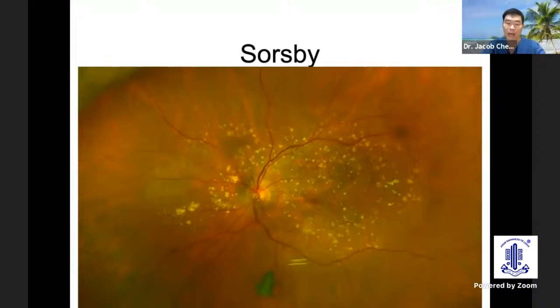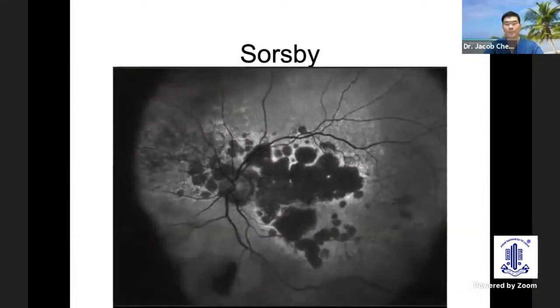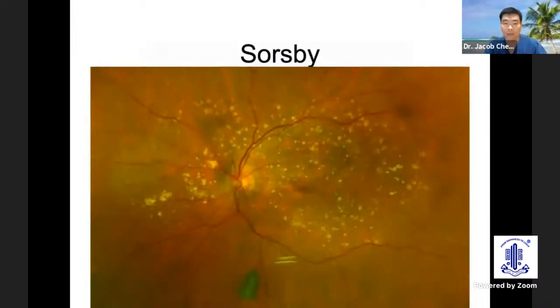Here is a follow-up after the patient's retinal hemorrhages resolved. You can see a nice broad white ultra-wide field picture of the patient's posterior pole with resolution of the retinal hemorrhages. Again, what is really useful here is the application of autofluorescence to show that the posterior pole has undergone atrophy of the RPE or retinal pigment epithelium, combined with the atrophy of the retina and choroid. The patient presented with poor vision in both eyes. And here is a close-up view of the patient's pathology, which you can't see on the fundus photograph.